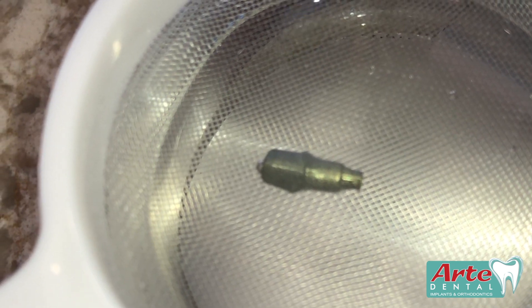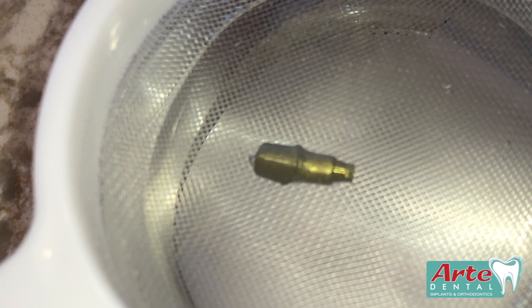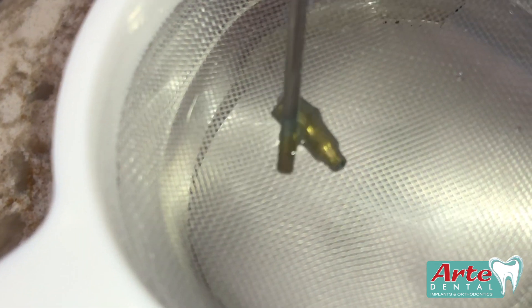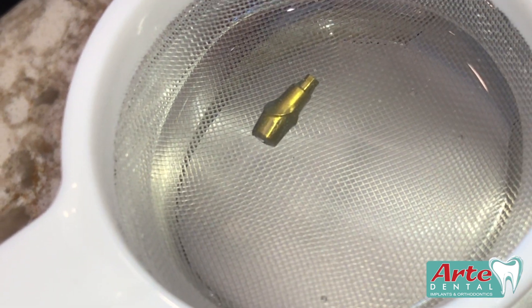It's almost a lighter green now and we're almost to gold. Keep going. And that's it — now we've got a gold abutment.